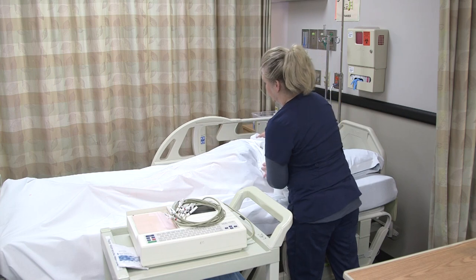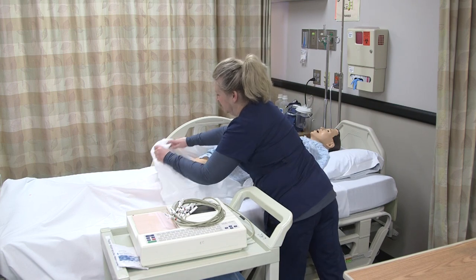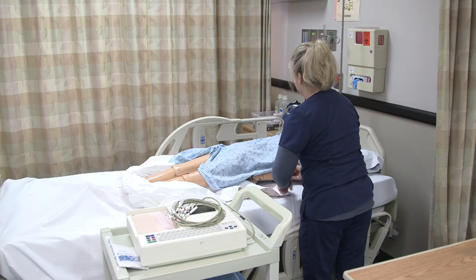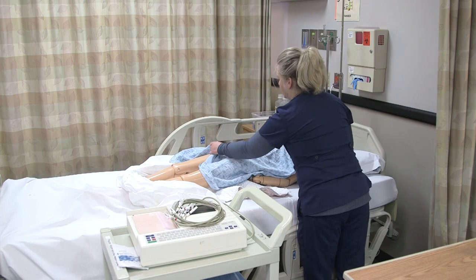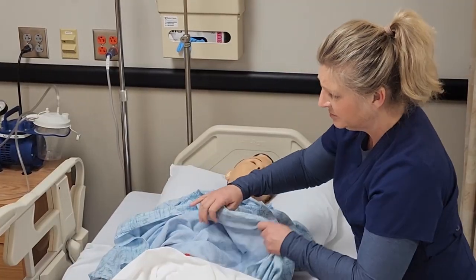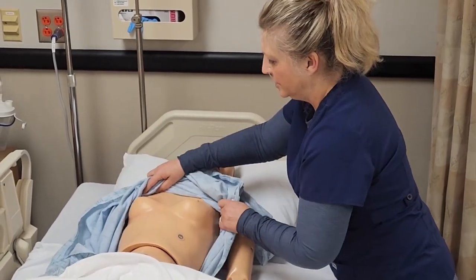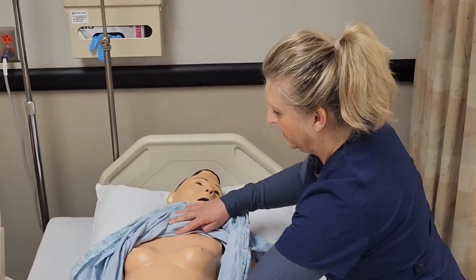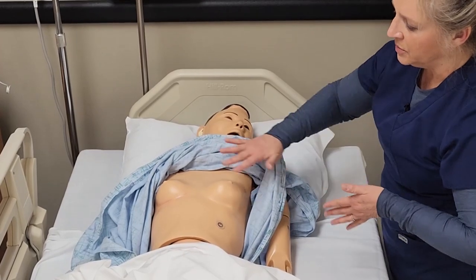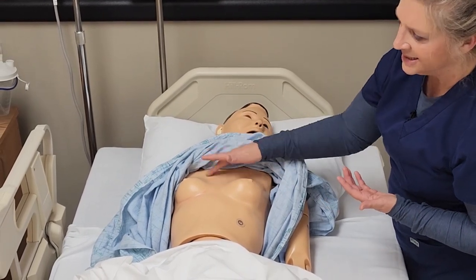Then I'm going to have to expose the patient — carefully expose the chest wall and down to the shin area. If tolerated, they should be lying supine. We can start with this area first so we don't have to expose everything at once. Make sure that if the patient has any moisture, you're wiping and drying that off so that the leads, or the patches, can stick to the skin.